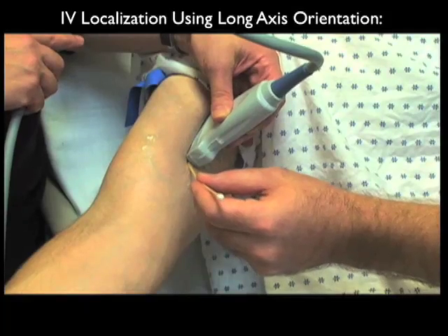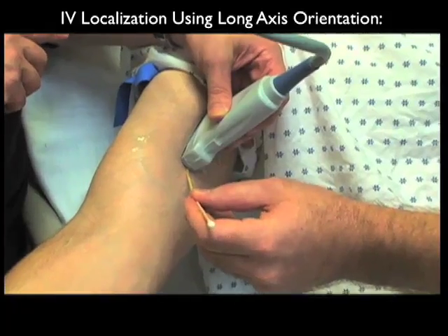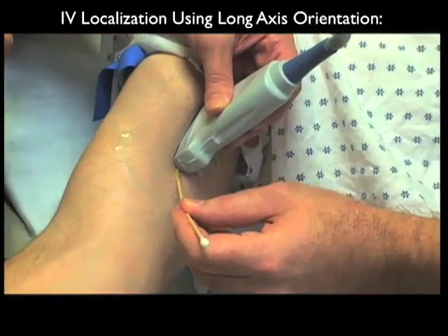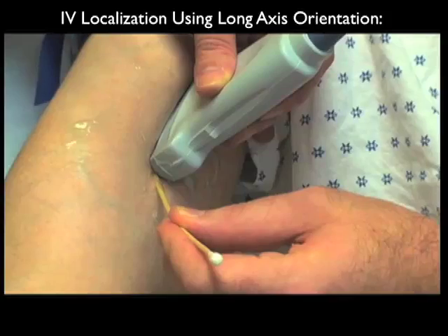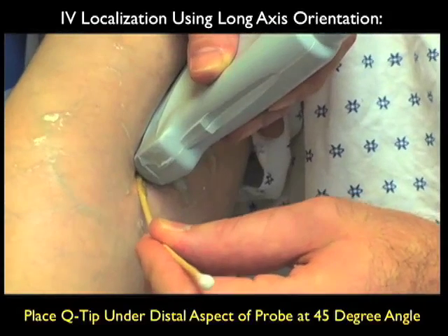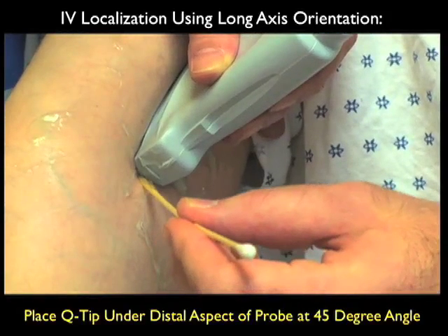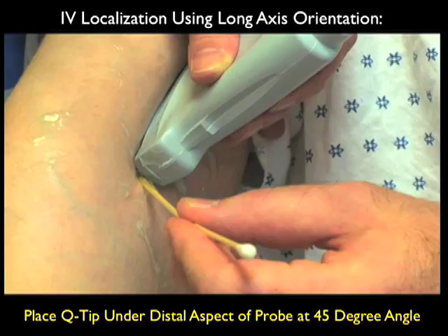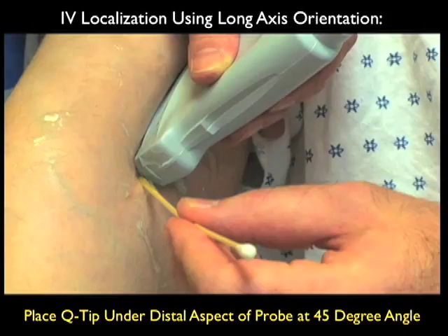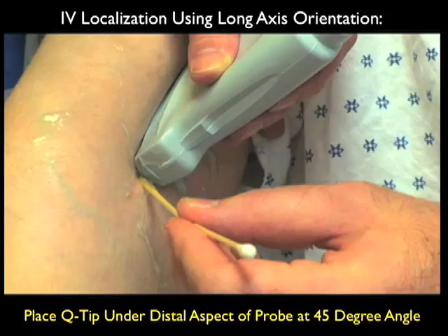We can also localize a vessel using the long axis technique. Notice here we have the probe oriented in an up-and-down configuration on the patient's arm, and replacing the Q-tip underneath the distal aspect again at a 45-degree angle to look for that ring-down artifact onto the vessel.